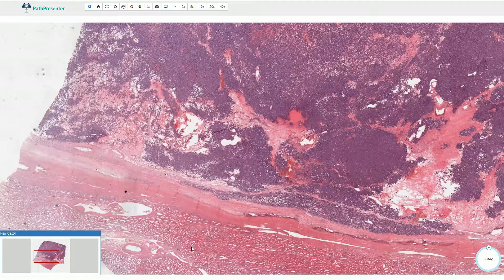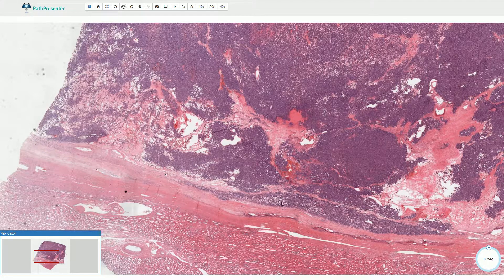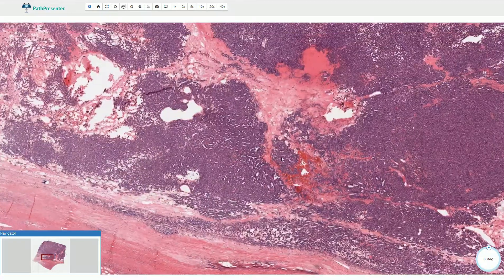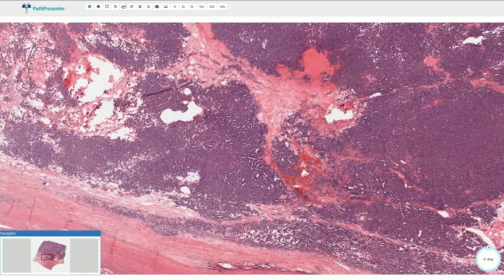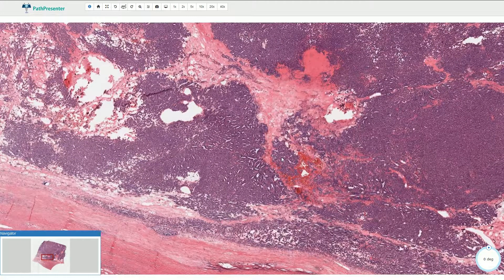Here we have the normal kidney parenchyma and here we have a part of the well-circumscribed lesion. The dark blue basophilic appearance on the low magnification is quite characteristic.